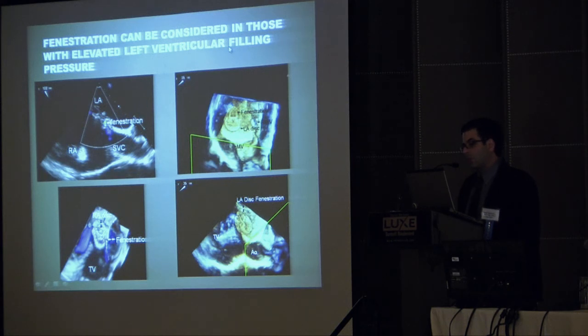And this is now a technique that's been published and used by various groups. Some people just put holes in the device. Some people stent the device open. But it's really nice to be able to visualize it this well live in the cath lab with one of our colleagues doing the transesophageal echo.